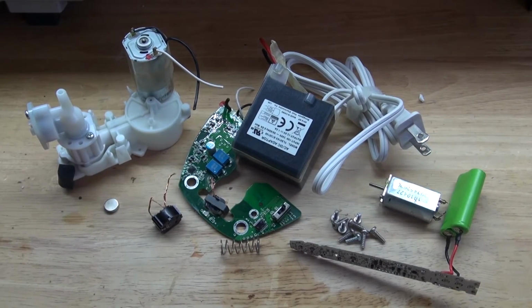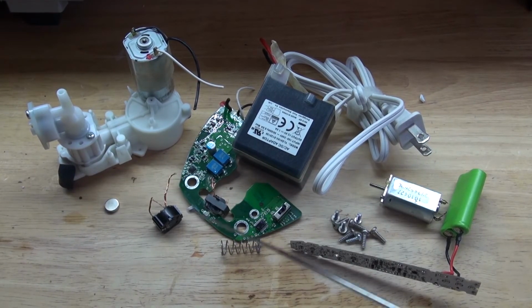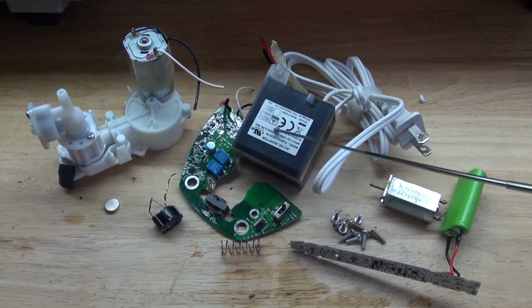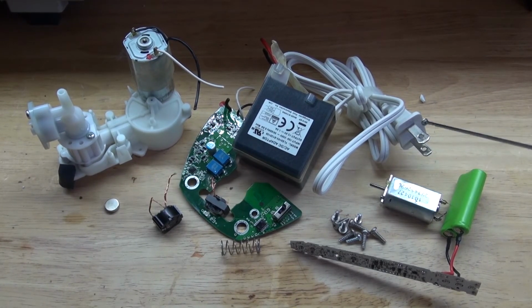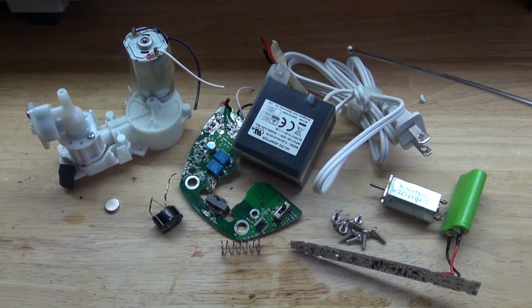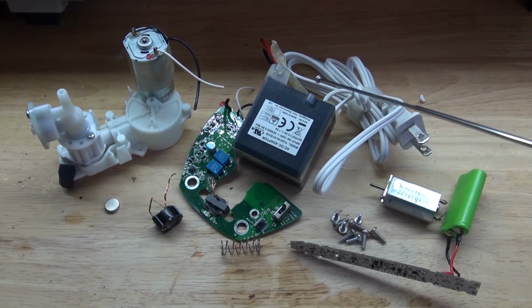Might even use it for some kind of wireless device by keeping the circuit intact. Not really sure, but I might do that. This waterproof 12-volt power supply is definitely something I want to keep, especially if I want to do some kind of project that requires something to be waterproof. Maybe even use it for this fountain, possibly.